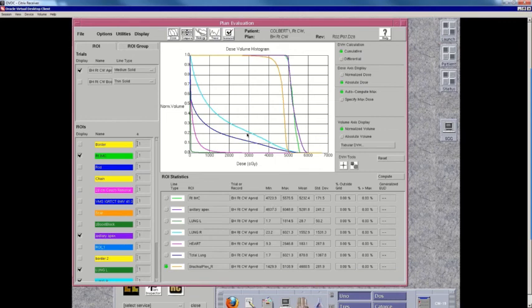My right lung dose. There's no great data in the literature about the optimal metrics, but what I typically try to do is keep my V20 at least less than 35%. We treat more and more patients in breath hold, and with breath hold, you can often keep it less than 25 to 30%, but this is reasonable. This patient had no lung problems at all. So her V20 was like 31%.